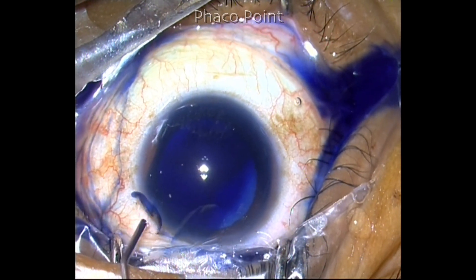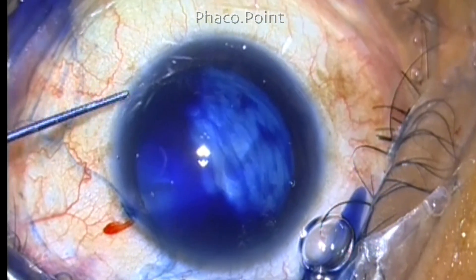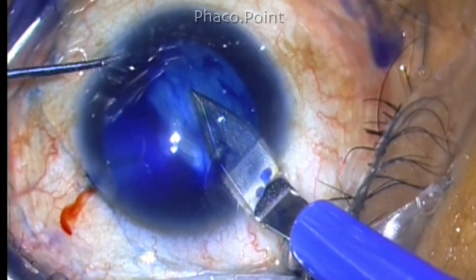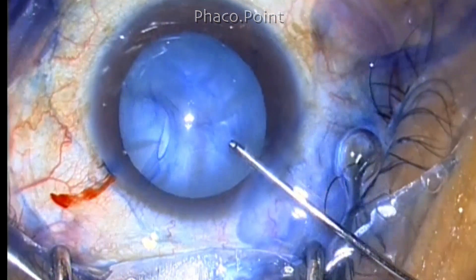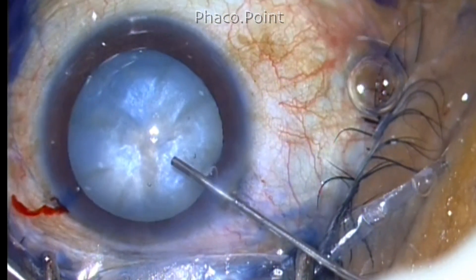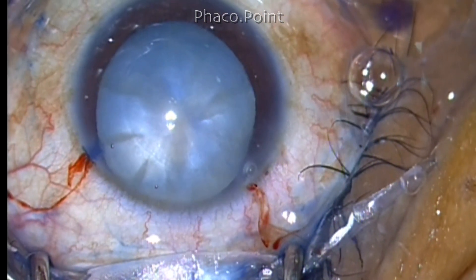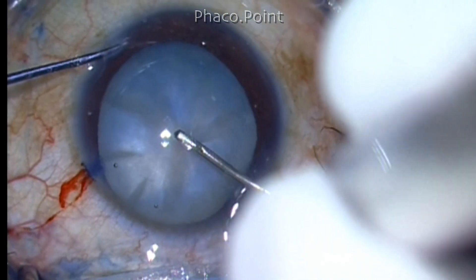Form the chamber with the viscoelastic before attempting the clear corneal incision. One of the biggest challenges in successfully performing phacoemulsification in an intumescent cataract is the ability to create a properly sized capsulorhexis. Because of the intralenticular pressure there is a high risk of getting an Argentinian flag runoff of the torn capsulorhexis edge. So the anterior chamber is deepened with Viscoat — a combination of chondroitin sulfate and sodium hyaluronate — and within the mass of that a little amount of methylcellulose is also injected. This tends to get trapped within the Viscoat, doesn't escape the eye, and also tamponades the central portion of the lens.